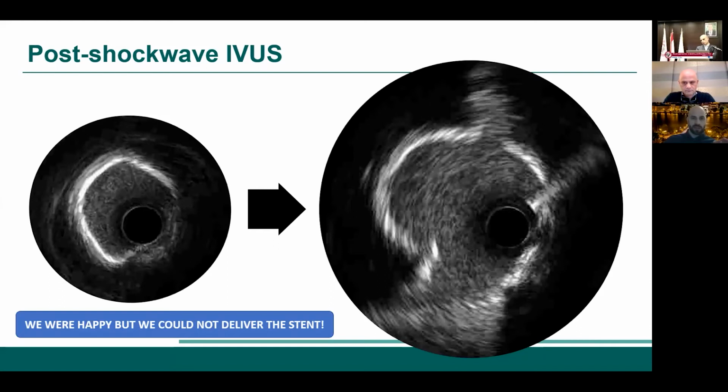Use an extra stiff coronary wire, preferably a guide extension catheter, and probably you need even a better stent. I do not know what you were using. I seriously have my doubts that rotational atherectomy would yield anything in this case.